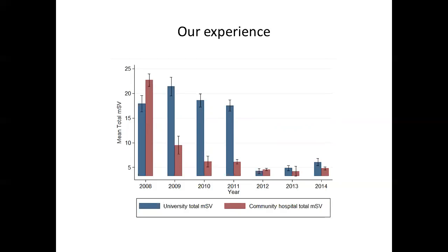That's for a study. Yeah, so that's how it used to be. It was all retrospective gating, so you're scanning throughout the cardiac cycle. None of the other technological advancement had happened, so it's not all their fault. It used to be 20 millisieverts. This is actually when we started reading, about 2012, and you can see how the doses just fell dramatically. It went up a little bit over time, and I think that reflects how people started hearing about coronary CT, and you started getting more complicated patients, where you do need to give more radiation to get good imaging. No, this is only coronaries. Yeah, exactly. So not TAVRs.